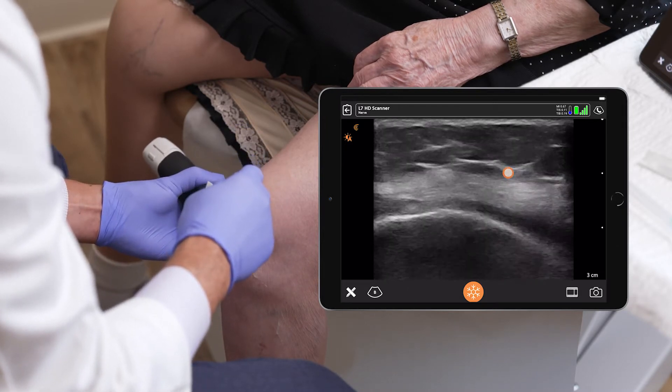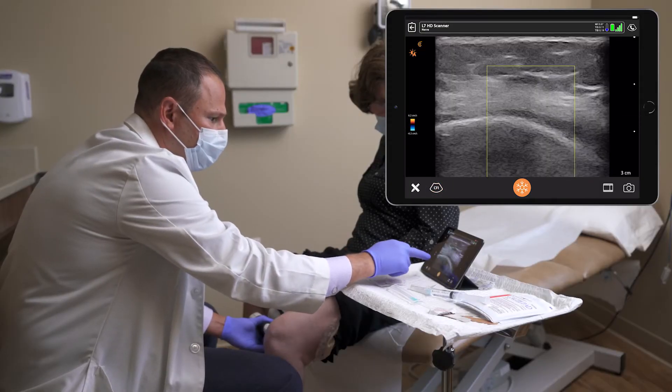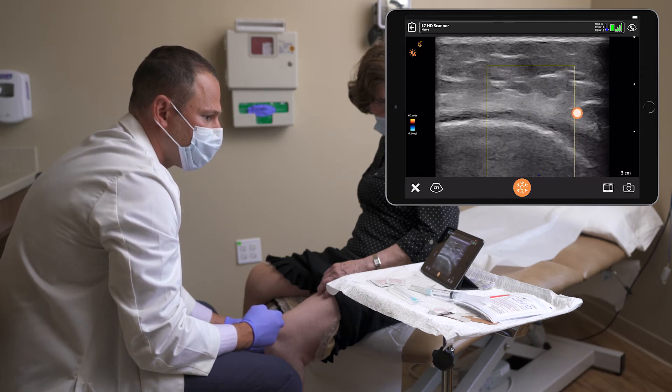Scanning distally, the nerve approaches the corner of the epicondyle with the blood vessel as it descends to innervate the knee.